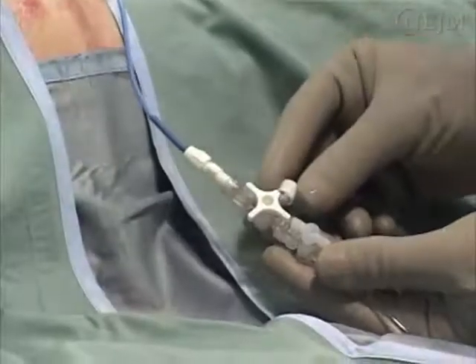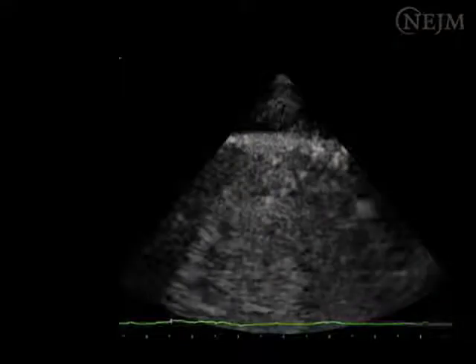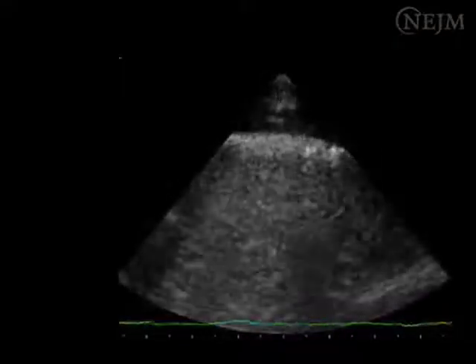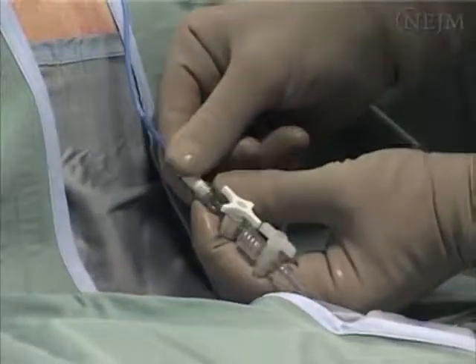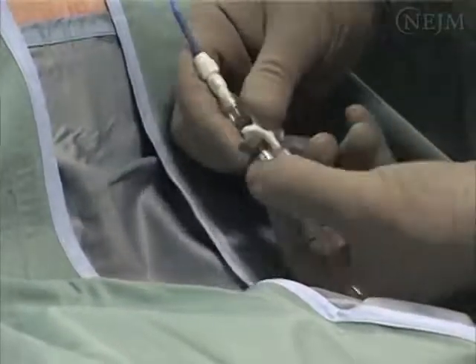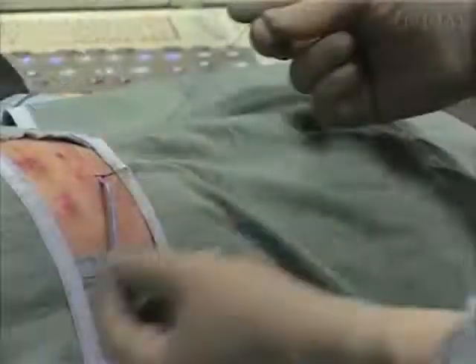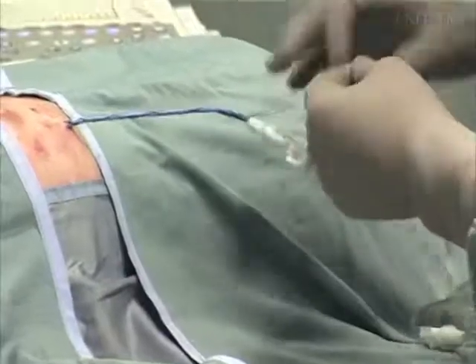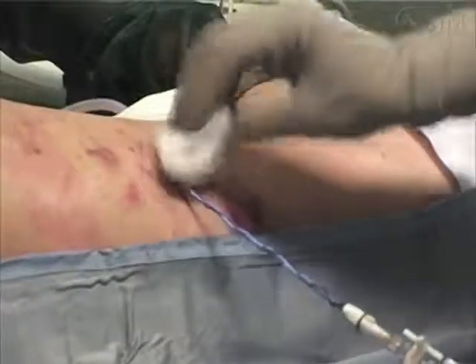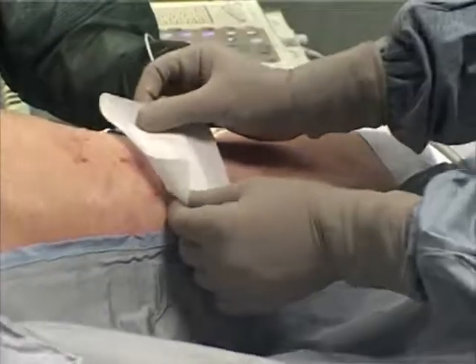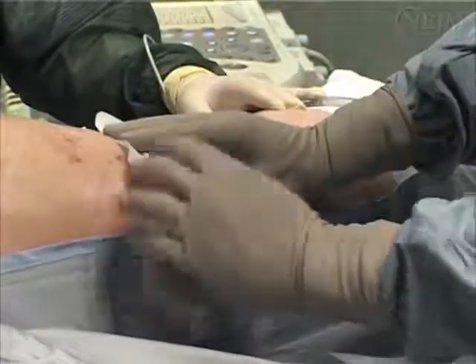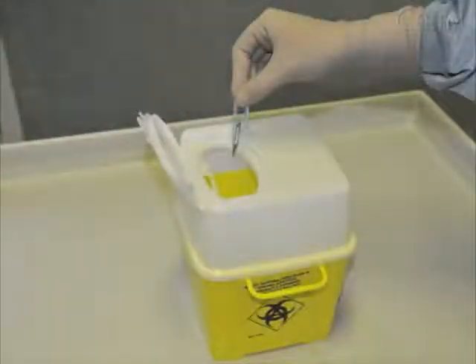Be certain that you have the stopcock in the correct position. Now perform a post-procedural check with the ultrasound unit to confirm the success of the procedure. Finally, make sure that all connections are secure to avoid accidental disconnections and entry of air into the pleural space. Secure the catheter with a surgical suture. Clean the surrounding skin and apply a sterile dressing. Make sure that the catheter is not bent or occluded by the placement of the dressing. All sharps must be properly disposed of according to local policy.